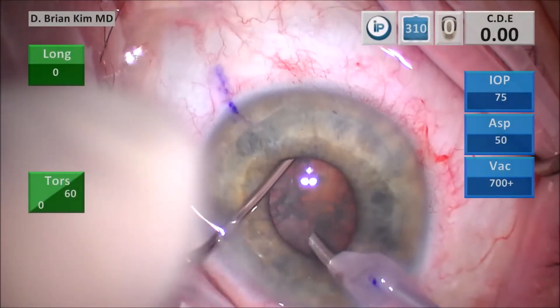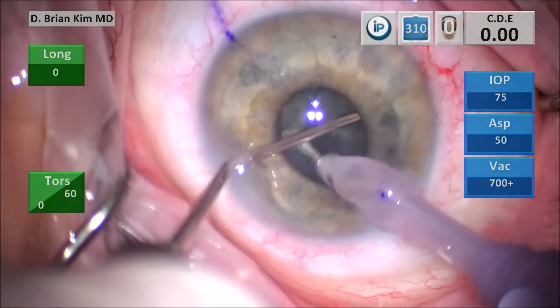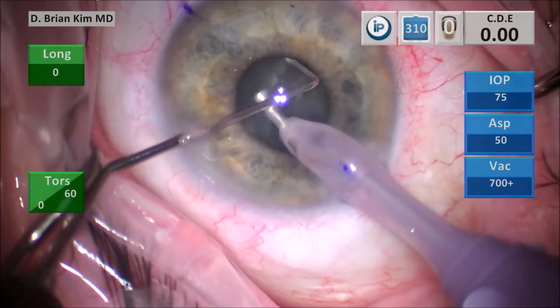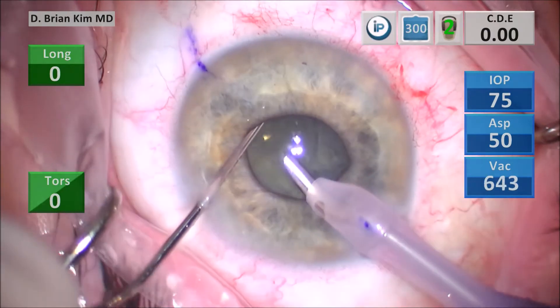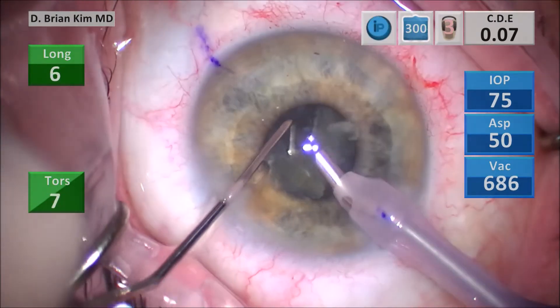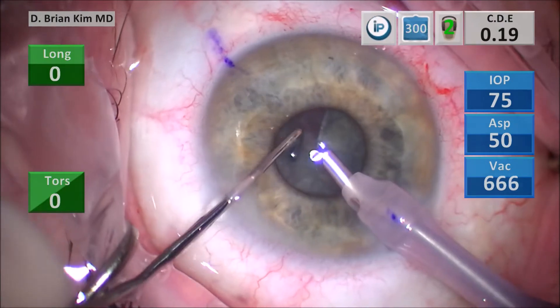I only use ultrasound and vacuum when I'm emulsifying the lens pieces. That was the double chop maneuver; now is the cross chop maneuver. With the double chop I get out to the equator, rotate the chopper so it holds the lens from below, lift up, then push down with the phaco tip on the surface of the lens and fracture it in half. I place the chopper out to the contralateral equator and fracture the contralateral hemi nucleus — all using mechanical forces only, without ultrasound or aspiration vacuum.